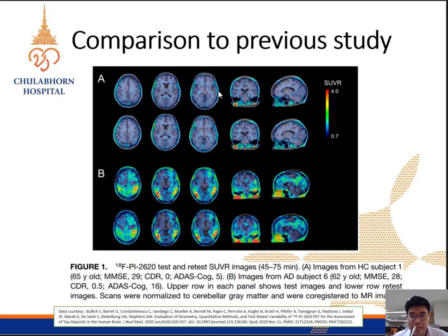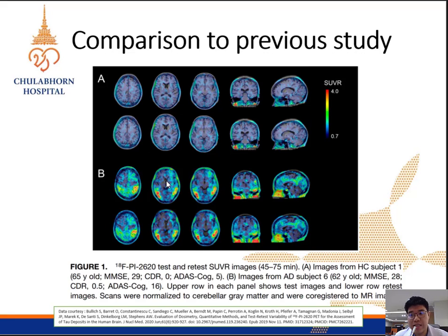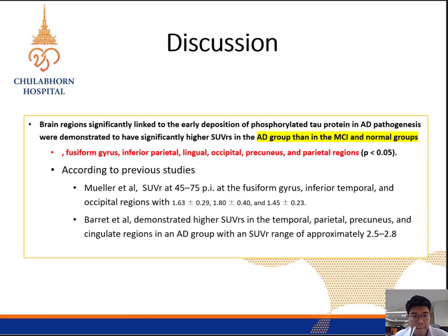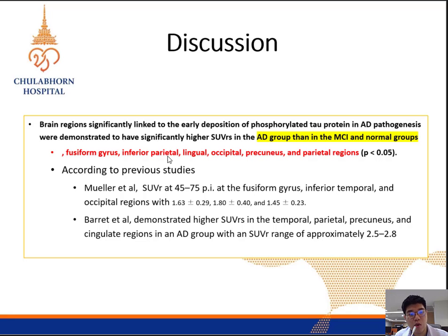We may see subtle off-target binding in the midbrain and cingulate gyrus. Our results are also correlated to previous studies of PI2620. The SUVR images of normal subjects, when visualized with the SUVR scale bar, are around 1, while in Alzheimer's disease subjects the SUVR may be up to 3 or 4. In the discussion, we can interpret that the AD group showed significantly higher SUVR in significant brain regions including the fusiform gyrus, lingual, occipital, precuneus, and parietal regions — consistent with researchers such as Muller who describe high SUVR of the AD group in comparable areas.